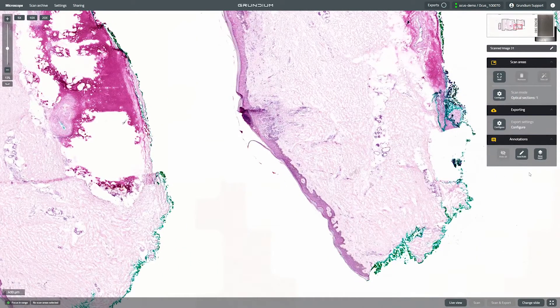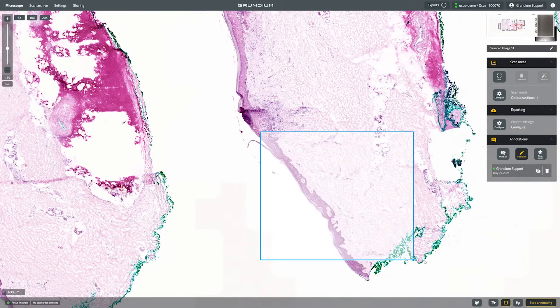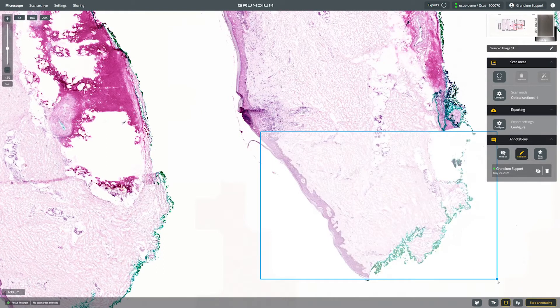Find your area of interest on the sample. In the Annotation toolbar on the right, click Add Edit. On the bottom right, select the Rectangle tool and draw a box around the area of interest.